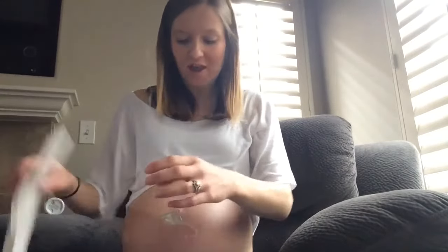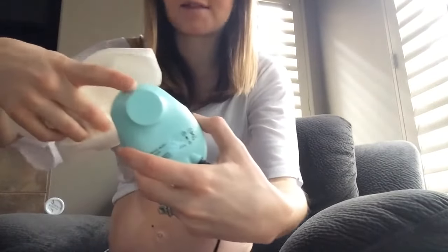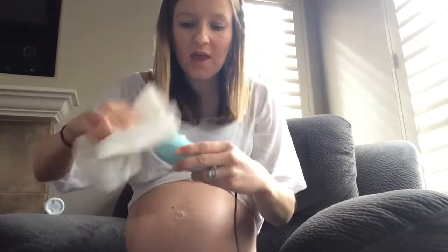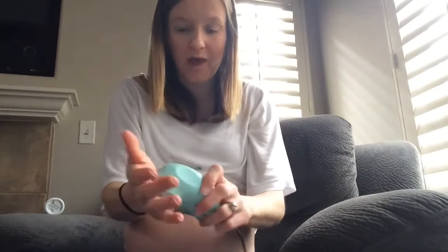Turn it down before you pull it off your stomach; otherwise there's a really loud noise that can be hard on your ears with earbuds. One thing to have handy is paper towels, because you get gel all over your stomach and the Doppler. I usually have some sitting nearby ready to clean up when I'm done. It's pretty easy to clean off — you don't want to use a ton anyway, so just wipe it all off. As long as you're careful, it does not get inside the audio jack.